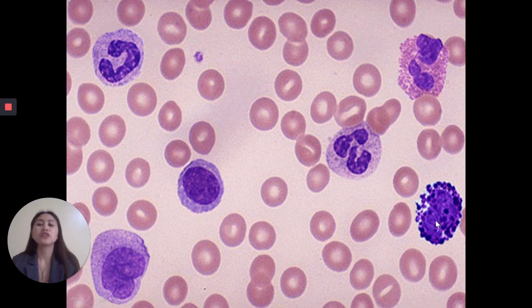Always memorize their characteristics, because when you find a particular WBC, you are expected to know it right away. You will not say, oh, what is this? Can I look at the atlas? No, you cannot do that anymore.